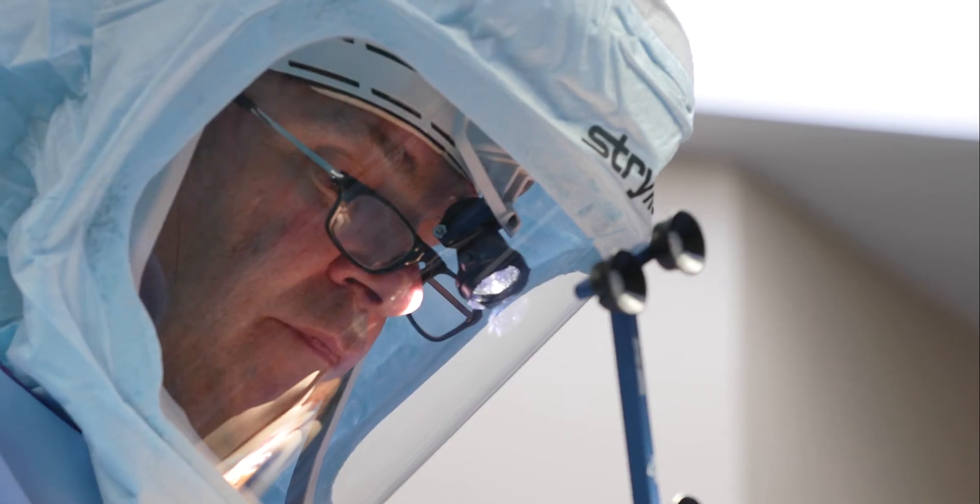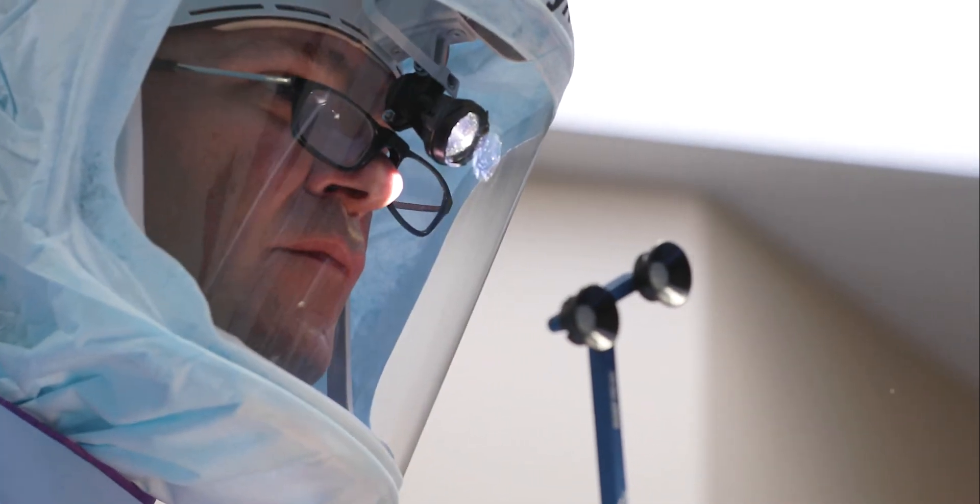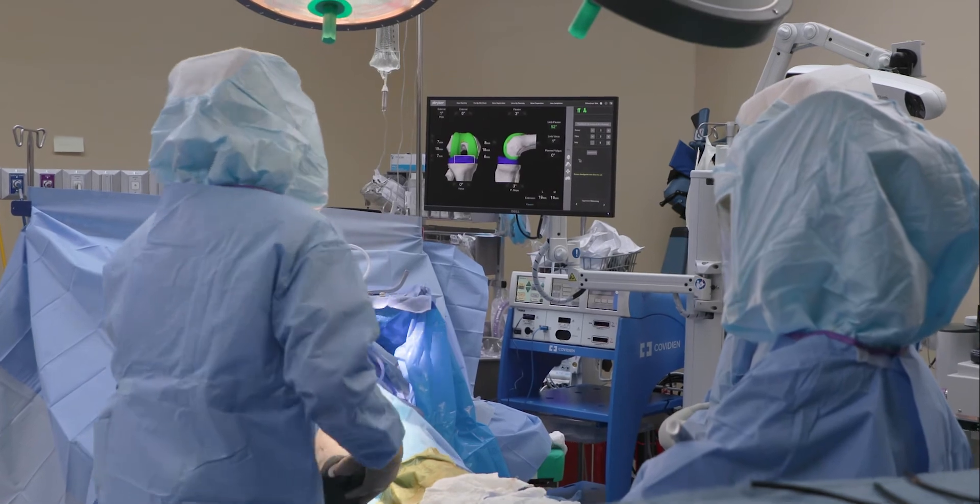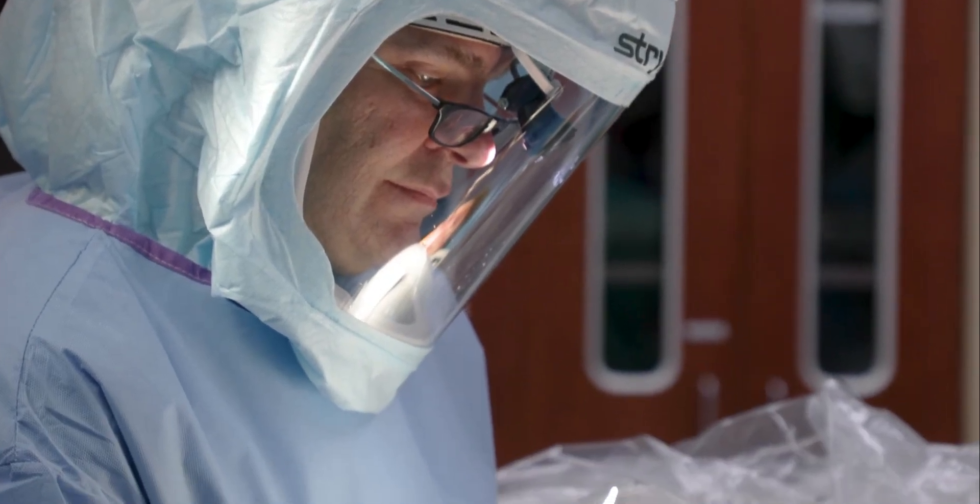What's remarkable is, normally during surgery, the surgeon is looking at the surgical field. With this system, we're looking at a screen that has a virtual knee up there. As you're making the cut, it's sort of like a very fancy video game. It shows the area going from green to a different color to show you that it's correct, and if somebody tried to force it in a different position where you're taking too much, it comes up red.